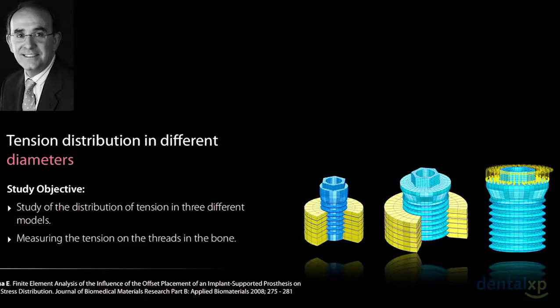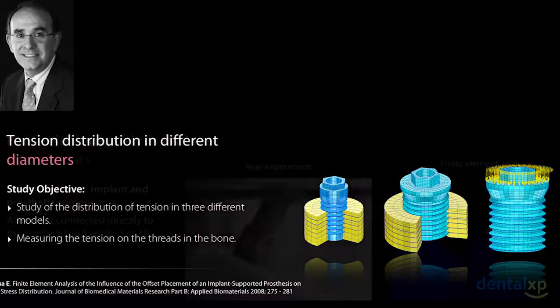Today, I want to talk about extra short implants. I published these articles 8 years ago, but believe me, in the last year I started to understand very well the meaning of this study.